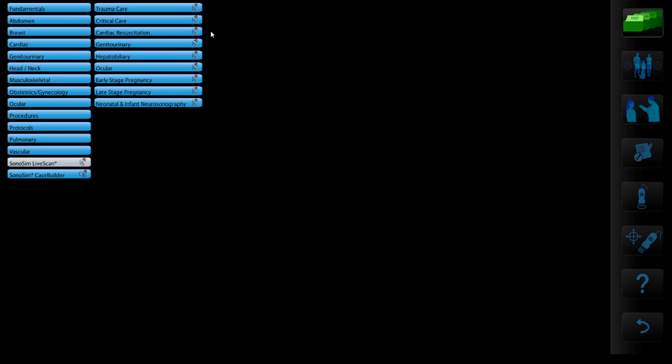Next, you will need to choose a case. SonaSim LiveScan has a large selection of pre-built cases broken up into categories: trauma care, critical care, cardiac resuscitation, genital urinary, hepatobiliary, ocular, early and late stage pregnancy, and neonatal and infant neurosonography.